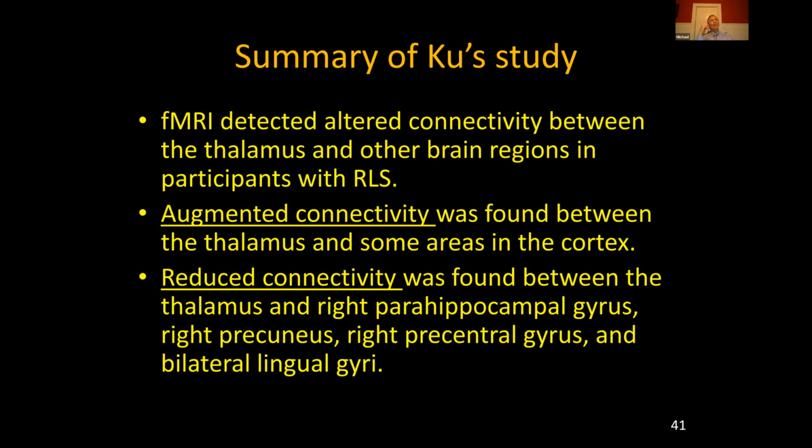Now, when we're doing a lot of imaging in the brain, there is a lot of lateralization. So when I see that things are more localized on one side or the other, the first thing I ask myself is, what's the handedness? Are people right-handed or left-handed? That impacts things. And also, based on some of the analysis techniques, if I see a lot of brain lateralization, it often makes me wonder about the technical quality of my imaging. So I'm often challenged to go back and look at that. If there's not a good neuroanatomic reason for the lateralization, then I have to think about the quality of the imaging.